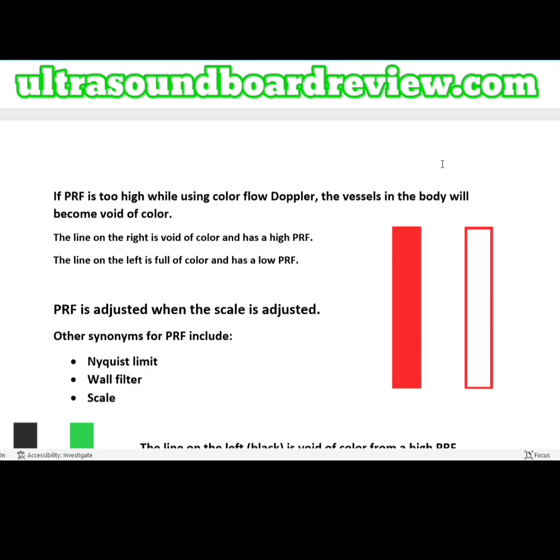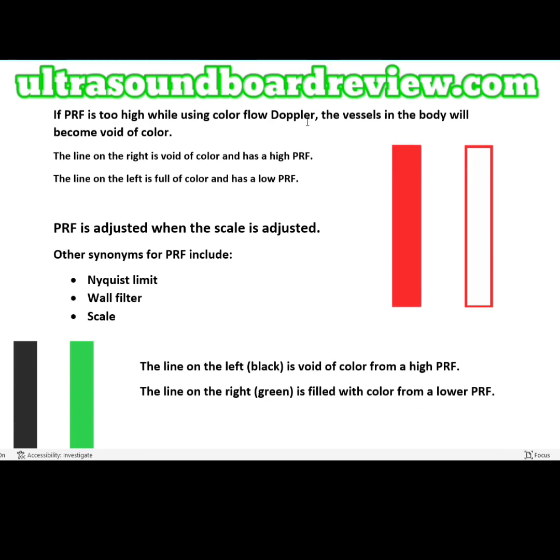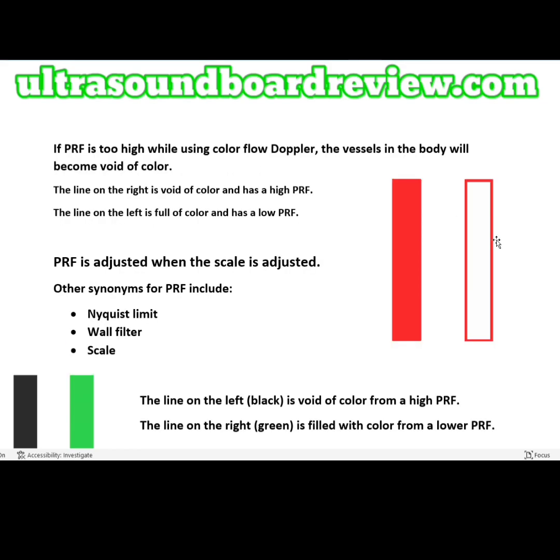Now, if your PRF is too high while using color flow Doppler, the vessels in the body will become void of color, which we talked about. In this diagram here, this line represents a vessel that's void of color, meaning the PRF is way too high, which is making the vessel void of color.